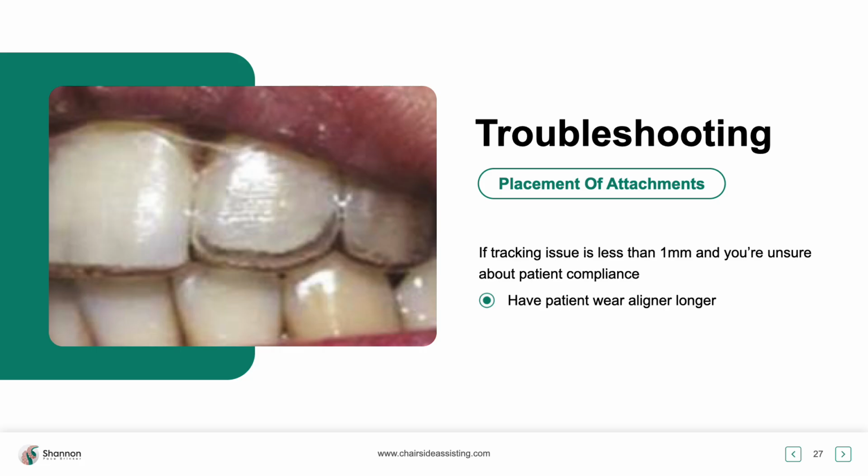So what we need to do is train our team up front. If they lose an attachment, and maybe they're on attachment number 15, like my daughter, she lost an attachment, and what we had to do is call or jump on myitero.com and order an attachment template at that phase. It takes about 2 or 3 days to get it, which is not life-threatening. Patient will come in a few days once the template comes in, and we will replace the attachment at that phase with that new template. All right? New template. Do not use the aligner ever, ever, ever.